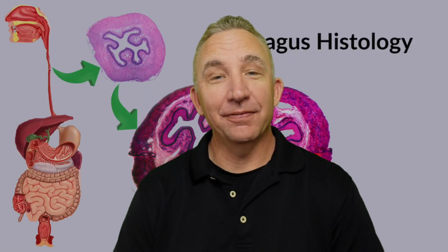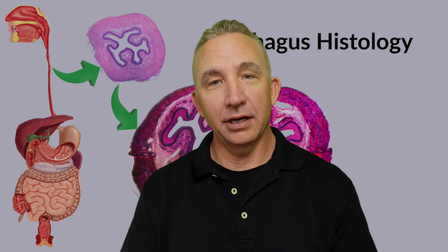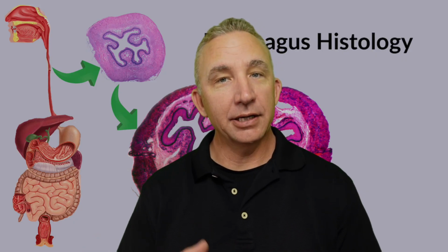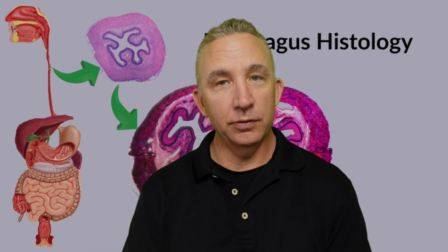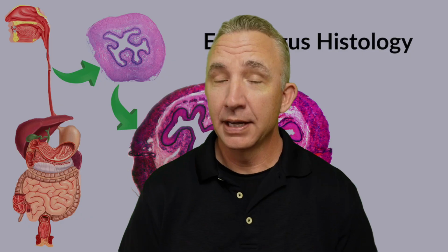In this video, we're going to focus on the esophagus and look at the histology. And we're looking at the slide and focusing on the 4 layers. If we review as we go through the digestive tract from the esophagus out through the rectum, it's lined with 4 layers. Where the food touches initially, we call that tunica mucosa because we tend to see mucus secreted there. Below that, submucosa because it's sub, the mucosa.